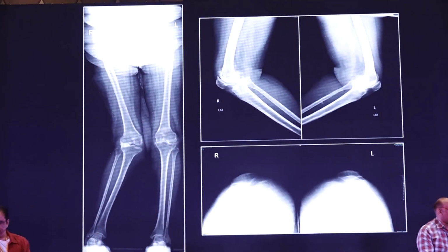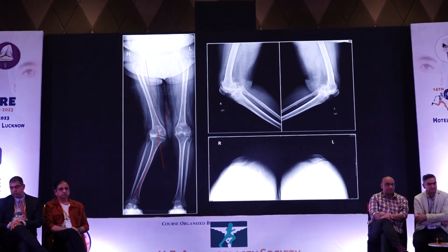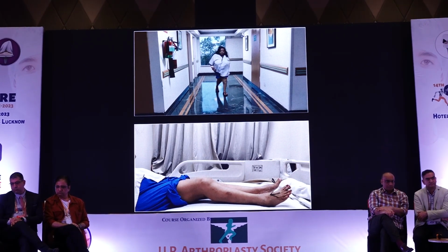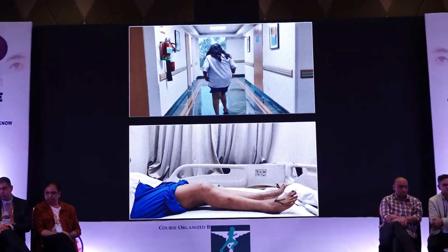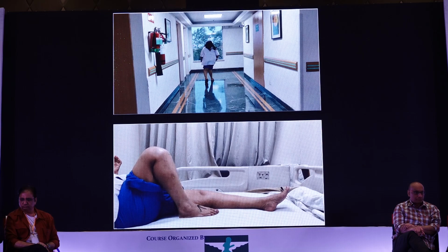So here we have a lady about 60 years of age with a valgus knee on the right side, about 15 to 20 degrees. Preoperative gait and range of movement. She had a correctable last 5 degrees of flexion deformity.